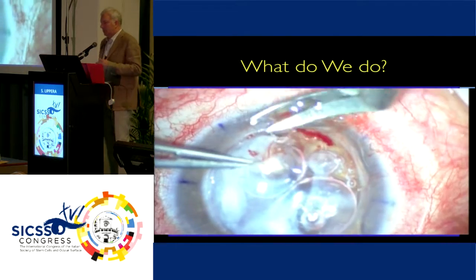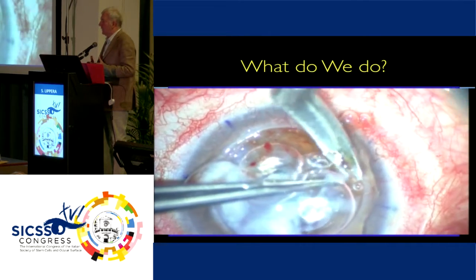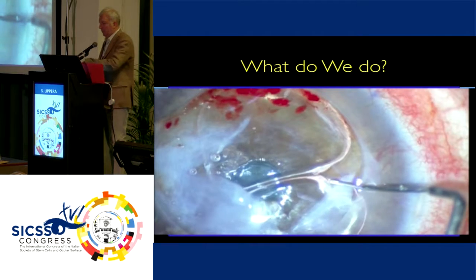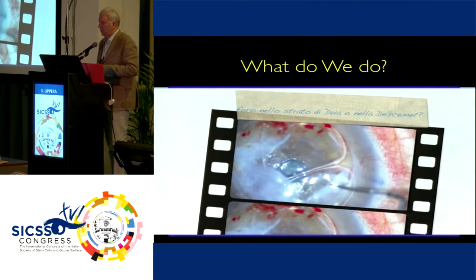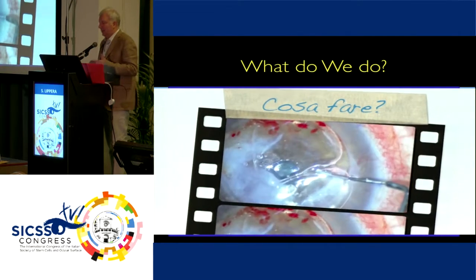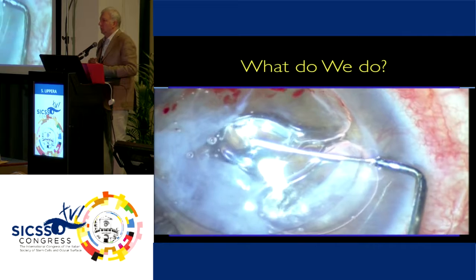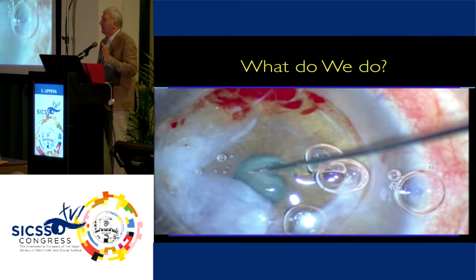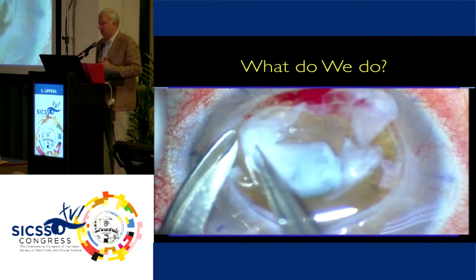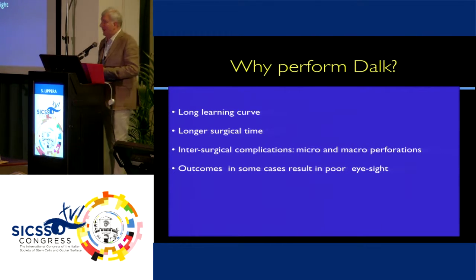But this is something that I failed to obtain in another case of herpetic keratitis where I had a hole and I couldn't really realize whether the hole was on the Descemet or the Dua layer. Actually, the hole that you see here close to the cannula was in the Descemet, whereas I have ruptured the Descemet, and then the rupture actually expanded, and at that point I couldn't but convert to PK. So I performed a PK, but the patient, however, obtained a good visual acuity as a result.